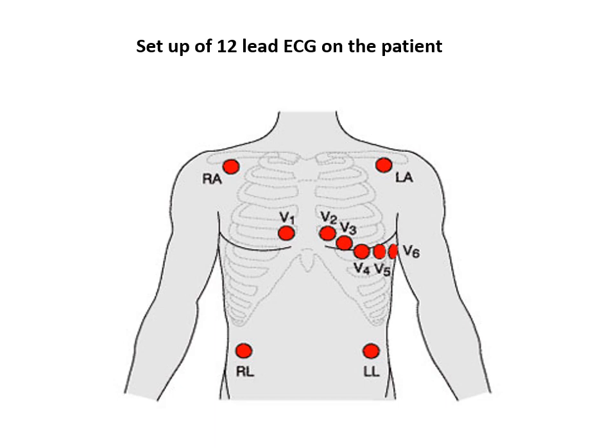So an ECG can allow us to diagnose what the abnormal rhythm is, and also an ECG can help us with diagnosing heart attacks, heart strain, ischemic heart disease, so a heart that is not receiving enough oxygen, such as in a condition called angina. We will get to these conditions as we go along. Don't need to memorize them all right now.